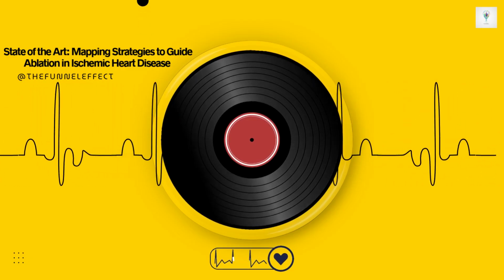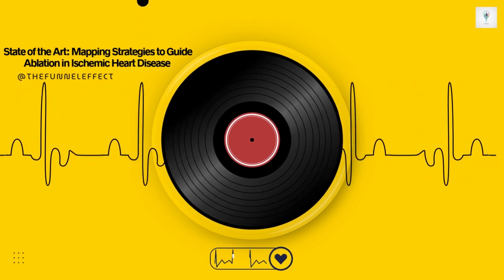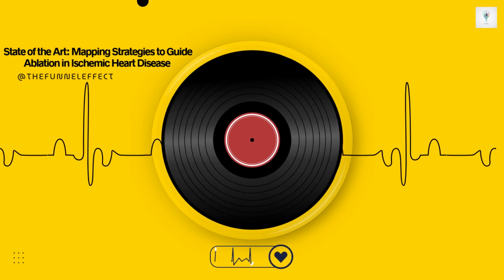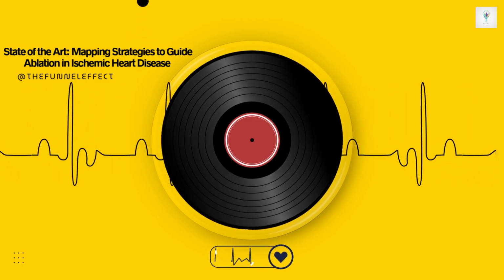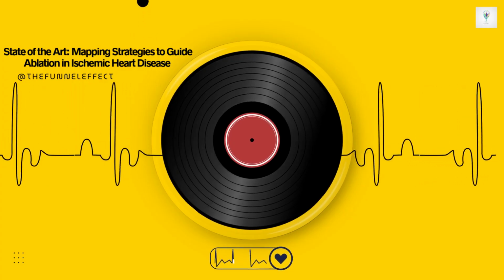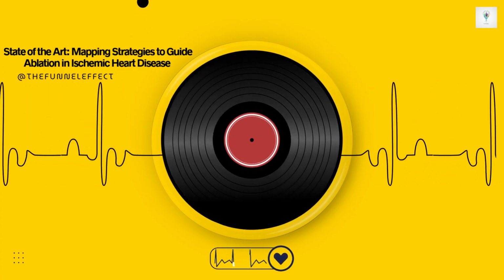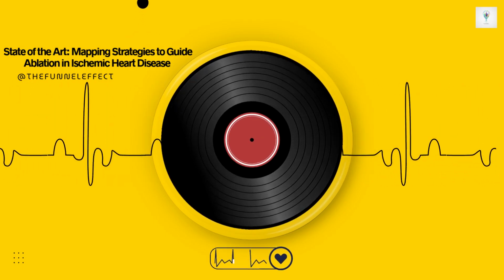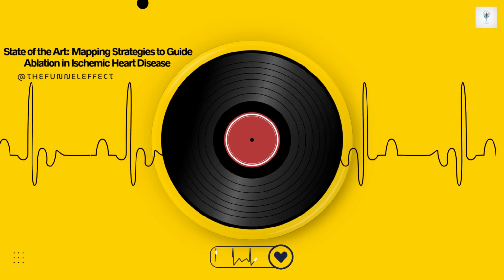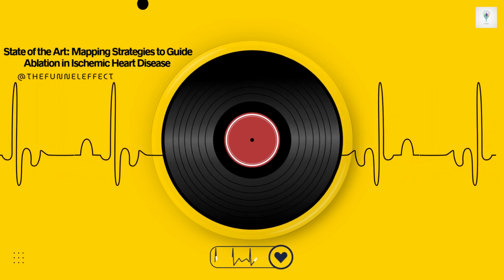But LPs have a significant limitation: the bystander issue. Meaning they're not specific enough? Precisely. LPs are everywhere in scar tissue. Yes, you'll definitely find them within the critical isthmus channel itself, but you'll also find them in adjacent areas of scar that are not part of the actual circuit. They're just innocent bystanders, electrically speaking. So you could spend a lot of time ablating a site just because it has an LP, but if that site isn't actually part of the critical pathway, the VT will continue.